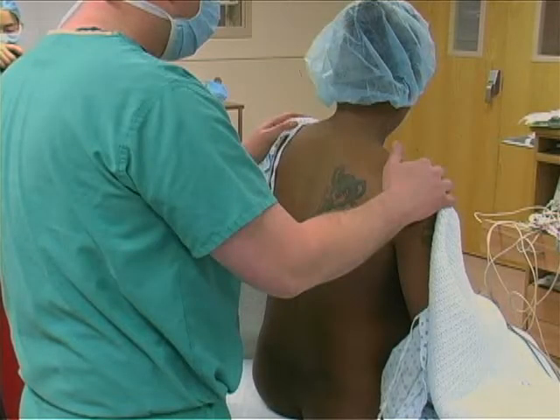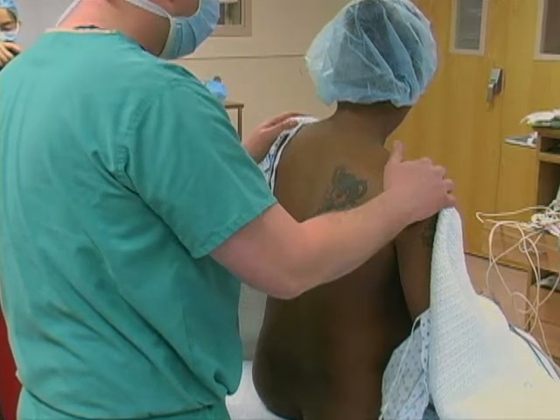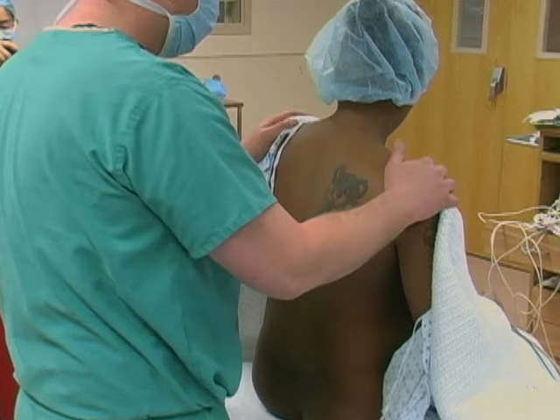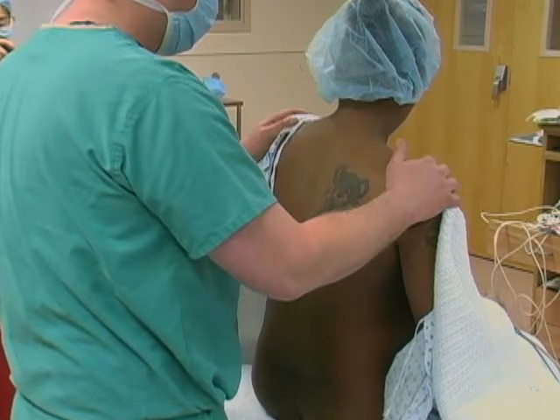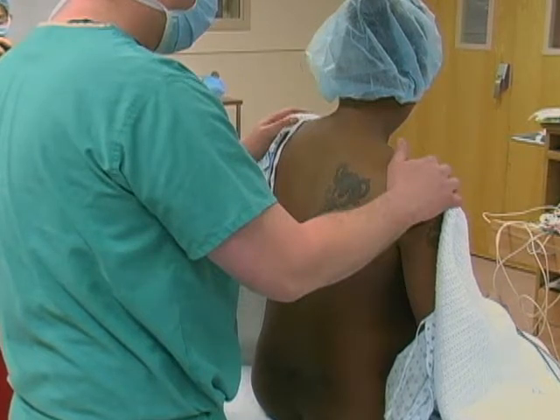The lumbar epidural is a neuraxial block designed to provide local anesthesia for surgical procedures, including urologic, gynecologic, and lower extremity operations. It has the added benefit of postoperative pain relief for these same procedures. It is also commonly used to provide analgesia for parturient women.